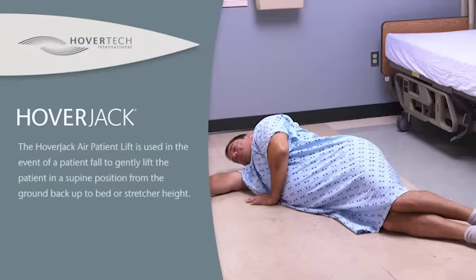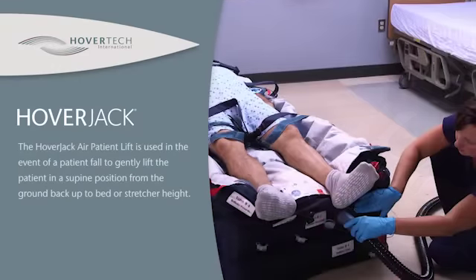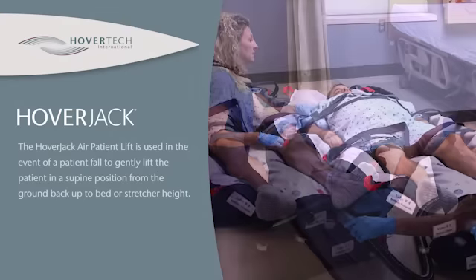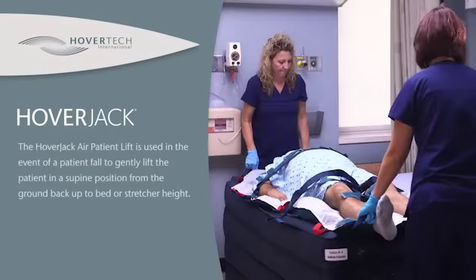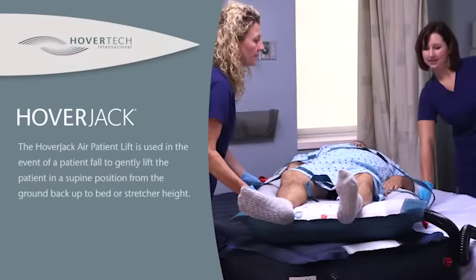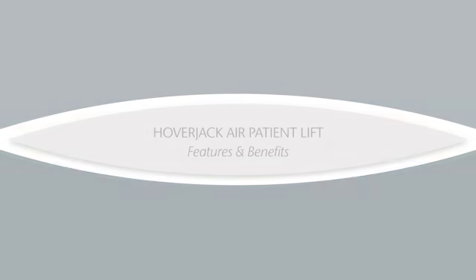The HoverJack Air Patient Lift is used in the event of a patient fall to gently lift the patient in a supine position from the ground back up to bed or stretcher height. This segment will train on the proper use of the HoverJack in conjunction with the HoverMat air transfer system.